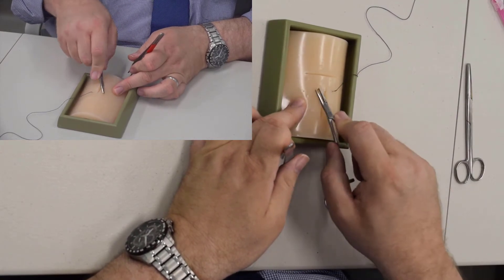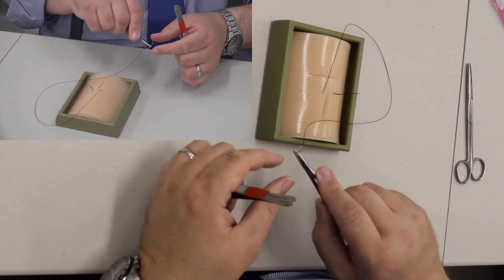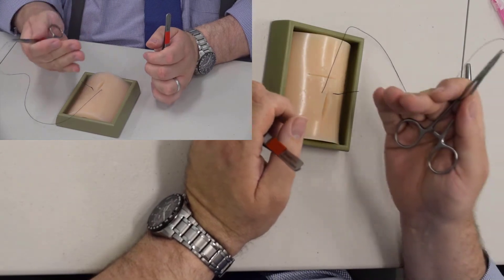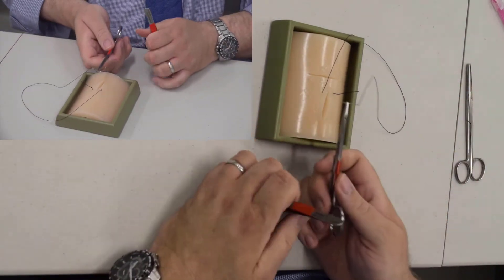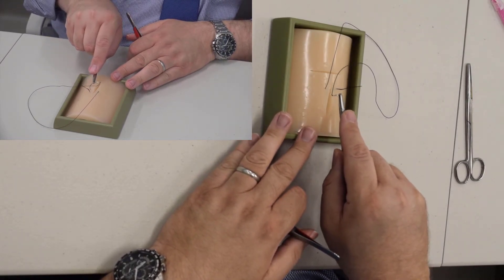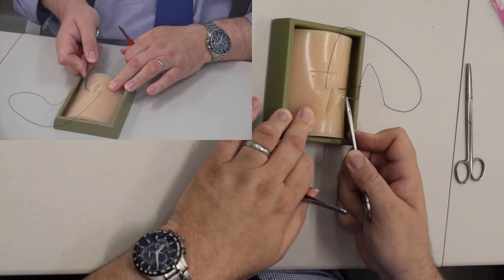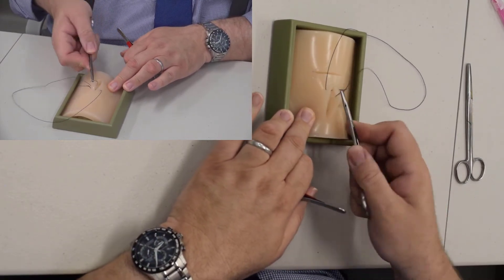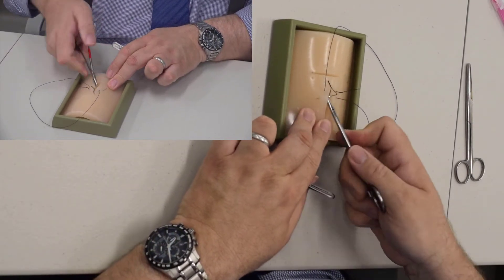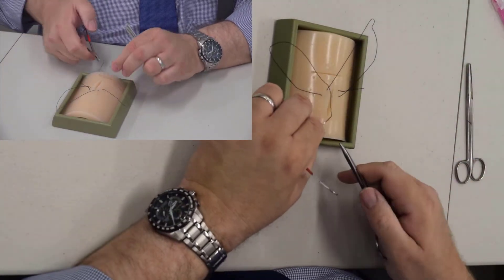This takes time to learn. Now I'm pulling my stitch through. It's legal to grab the needle and to reload the needle driver — but notice, fingers are not in the holes. Stitch at 90 degrees. Go back until your needle is perpendicular to the skin, rotate your wrist. You can do it in one bite or two bites — one half of the skin, then back through the other half, or all in one hand motion if you prefer.